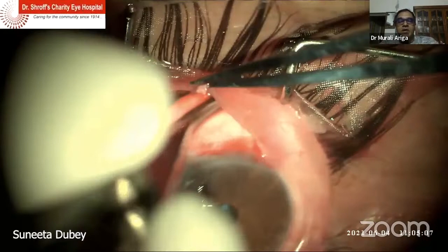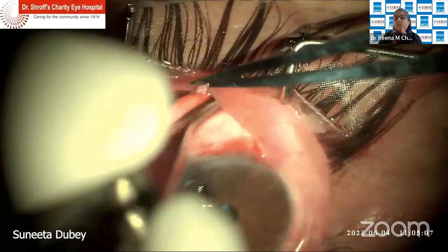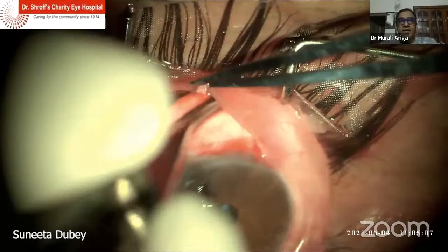and I usually use a 0.2 mg/mL concentration and leave it for between 1 to a maximum of 3 minutes, depending on the type of surgery, whether it's a resurgery or a secondary glaucoma or a young patient, depending on the risk of fibrosis and failure. Depending on the duration, you can vary between 1 to 3 minutes and make sure the mitomycin sponge is pushed well away from the edge of the cut conjunctiva, and keep it covered for some time.